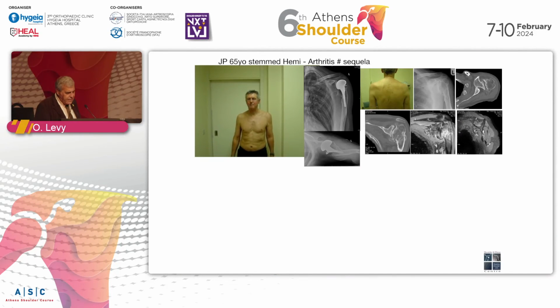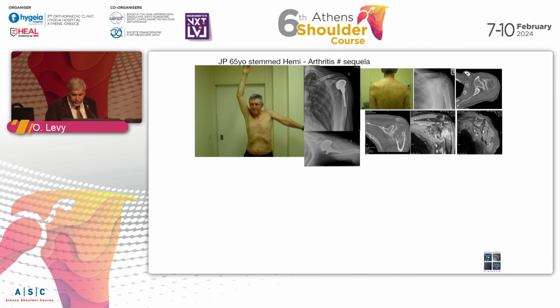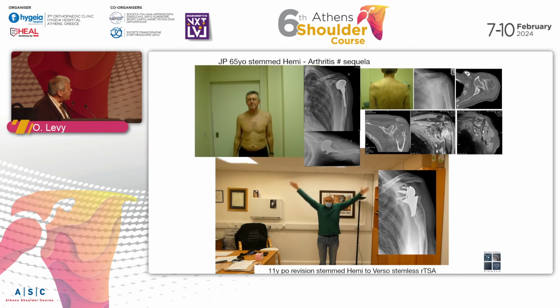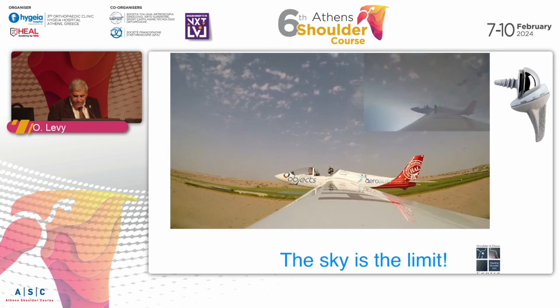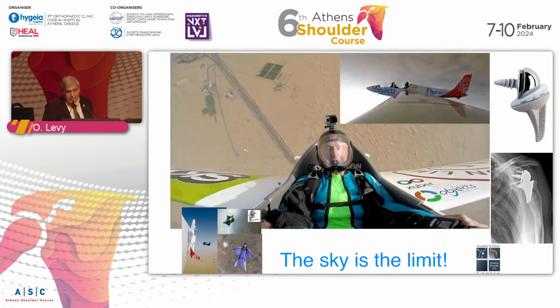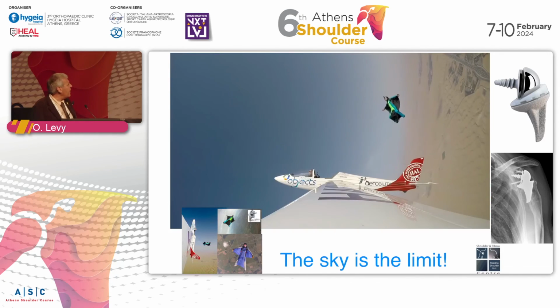And for instance, this gentleman, as you can see, with fracture sequela, someone did a hemi on him, and then he was referred to me, and I revised him to a verso. You can see that this is 11 years after the operation, a good function, and that's what this guy is doing. And it's a bit crazy. I don't recommend it to all my patients. But that's what he did.